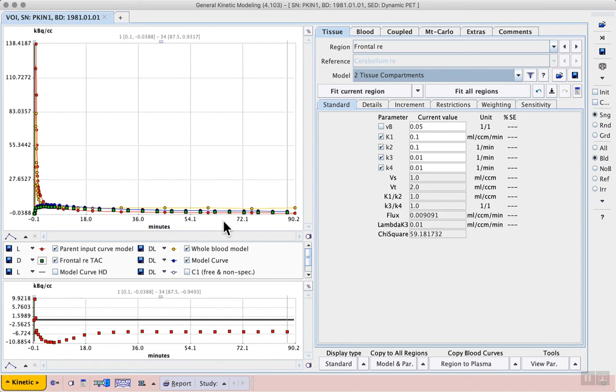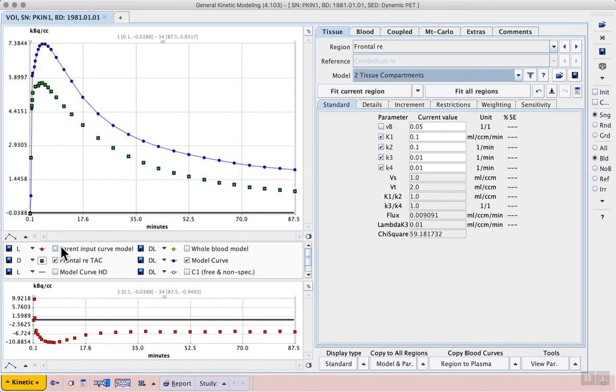To see the correspondence between the model data and the measured time activity curve we can hide the blood curves again. We see that we already have an appropriate shape but we don't yet have correspondence between the two curves.